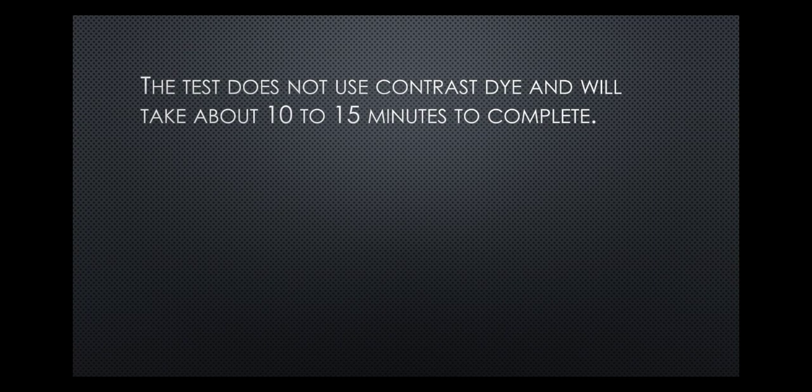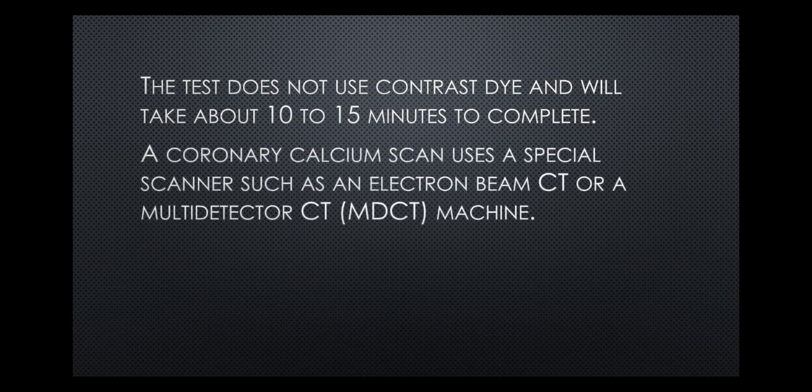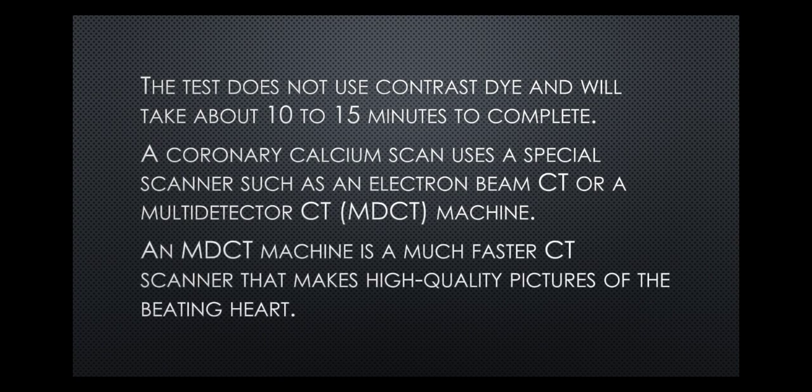The test does not use contrast dye and will take about 15 minutes. A coronary calcium scan uses a special scanner, and this is called a multi-detector CT machine. A multi-detector CT machine is much faster than the conventional CT scanners and makes high-quality pictures of the beating heart.